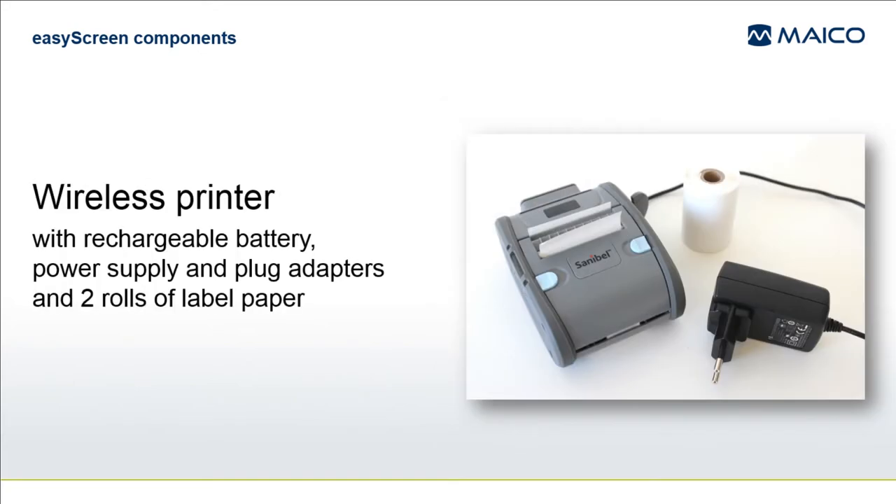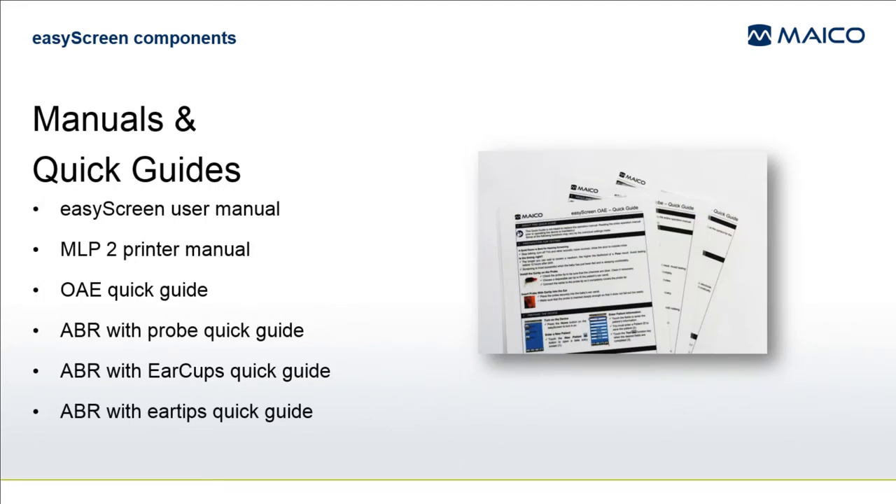If your purchase included the wireless printer option, it will be present in the package with its rechargeable battery, power supply with plug adapters, and two rolls of label paper. Manuals and quick guides will also be found — only the material appropriate for your system configuration will be included.